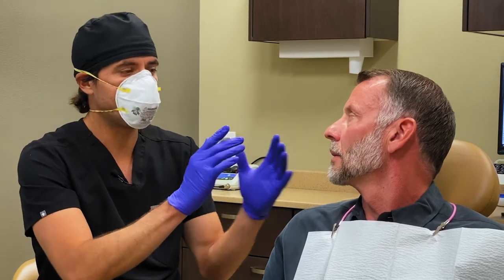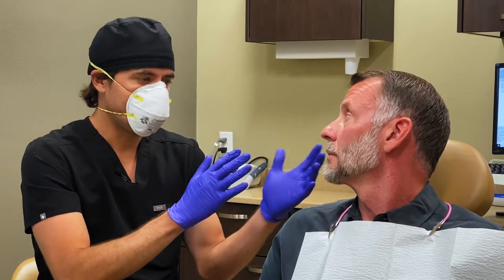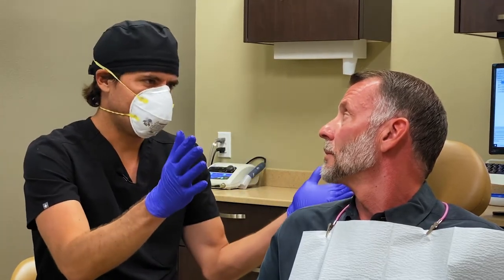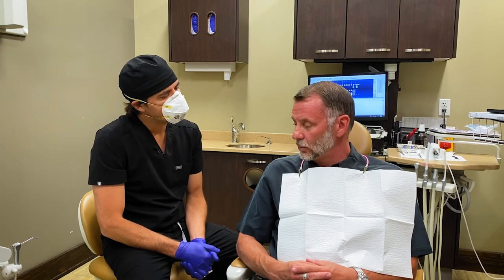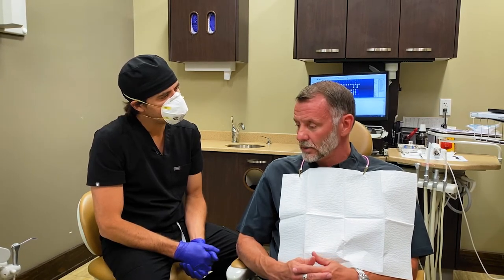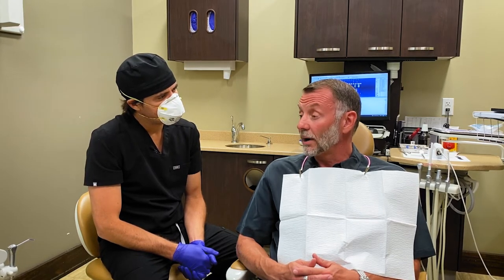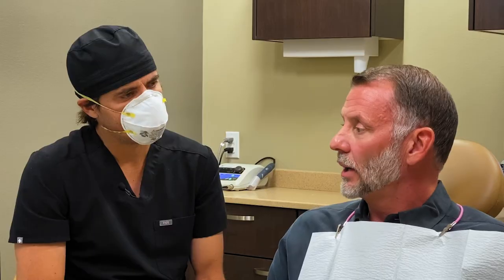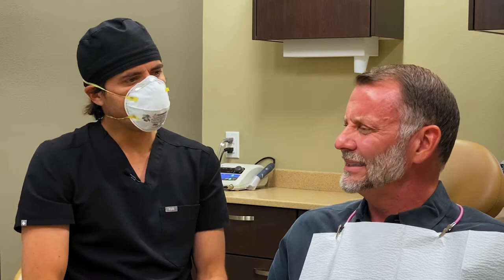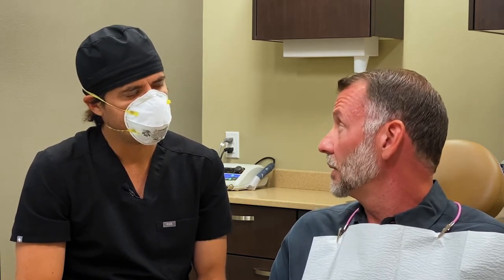Today is the day we're going to do the custom shade — we'll take pictures and match everything. So if we need to do a new set with changes, we'll do it with the correct shade for the finals, and the finals will have all that info. I think that was very wise. When you said don't judge how it feels right now — try it out for at least a week — that was right, because when I left here I thought it felt really funky, but it really did settle in.